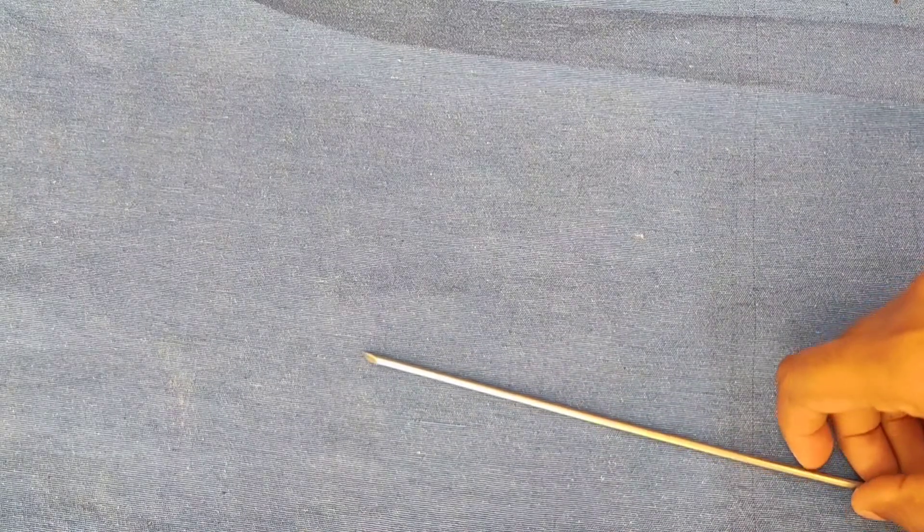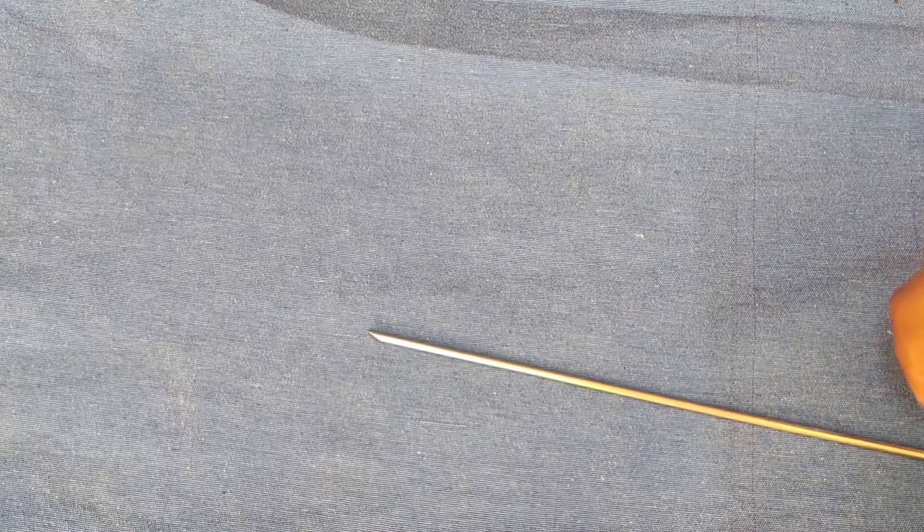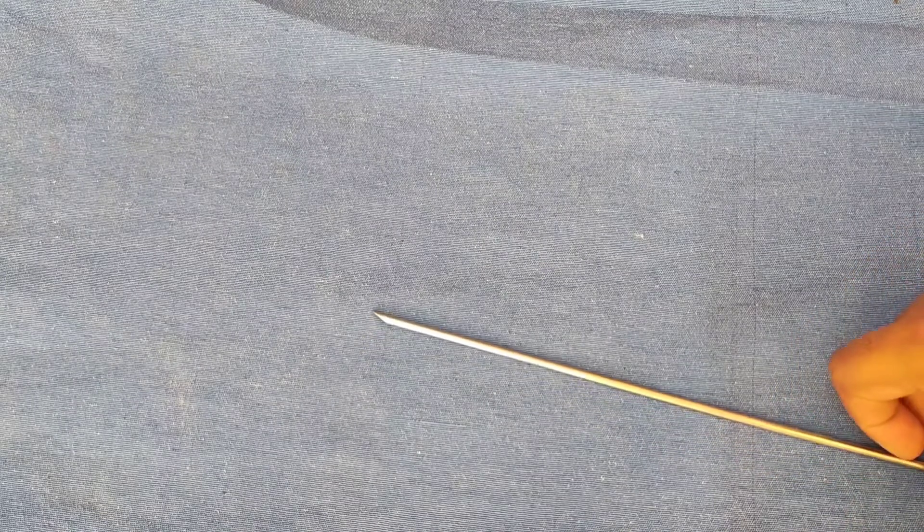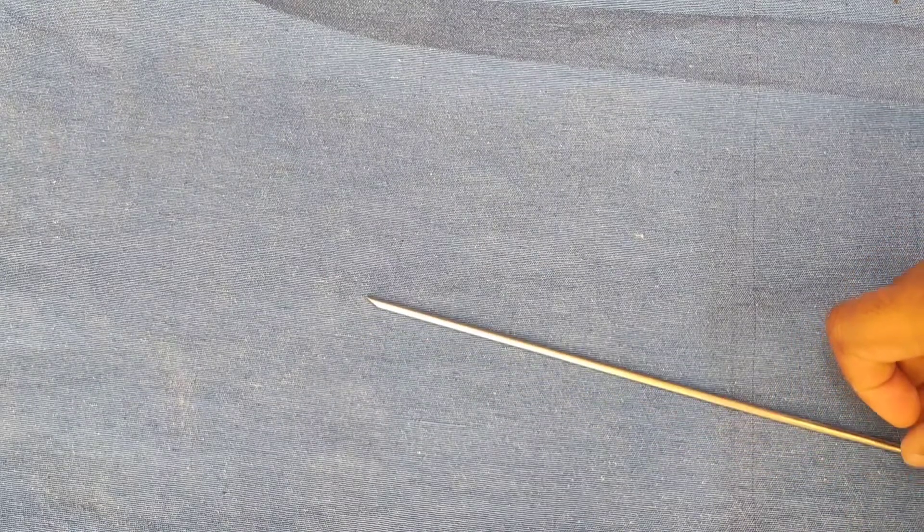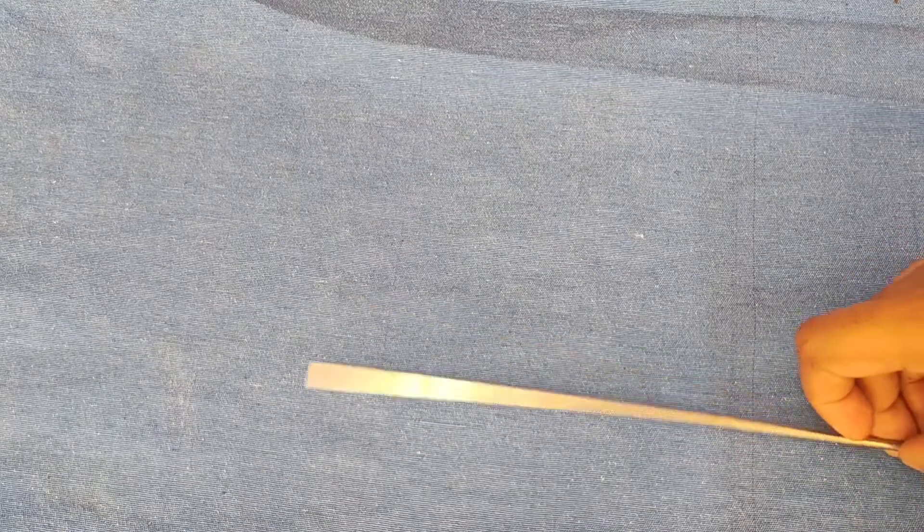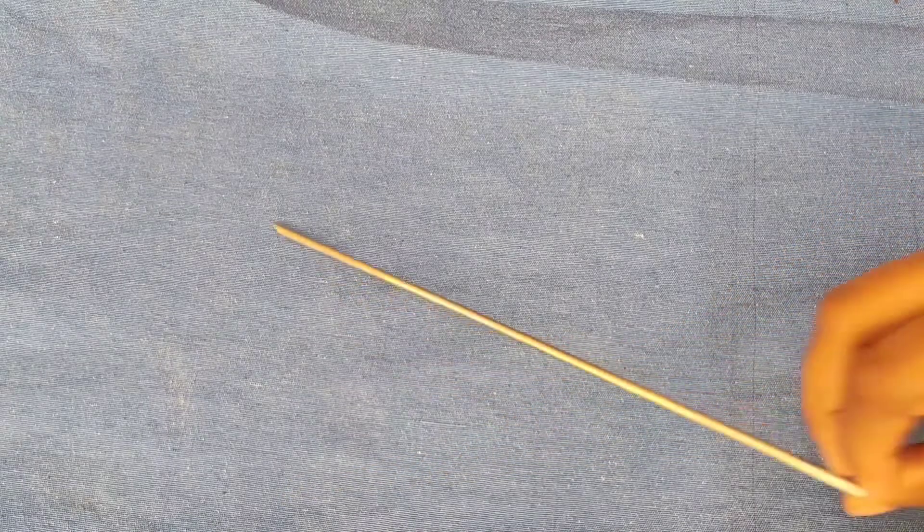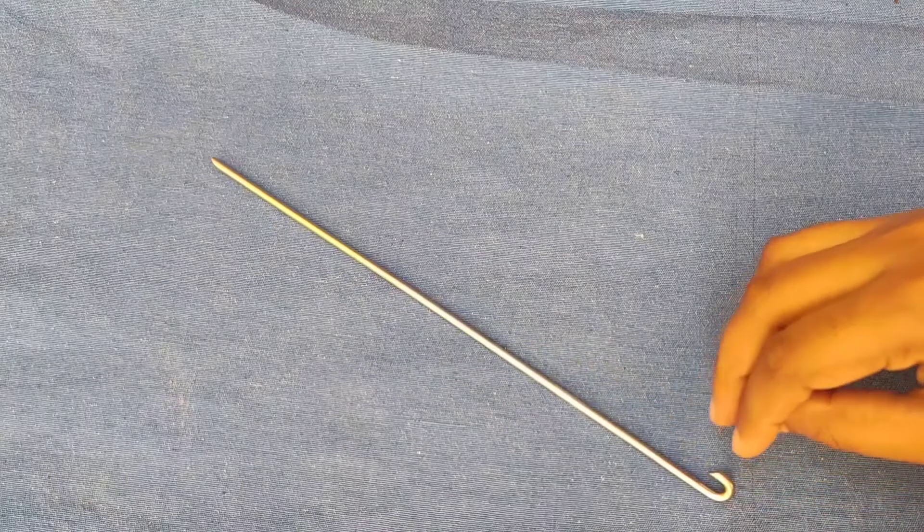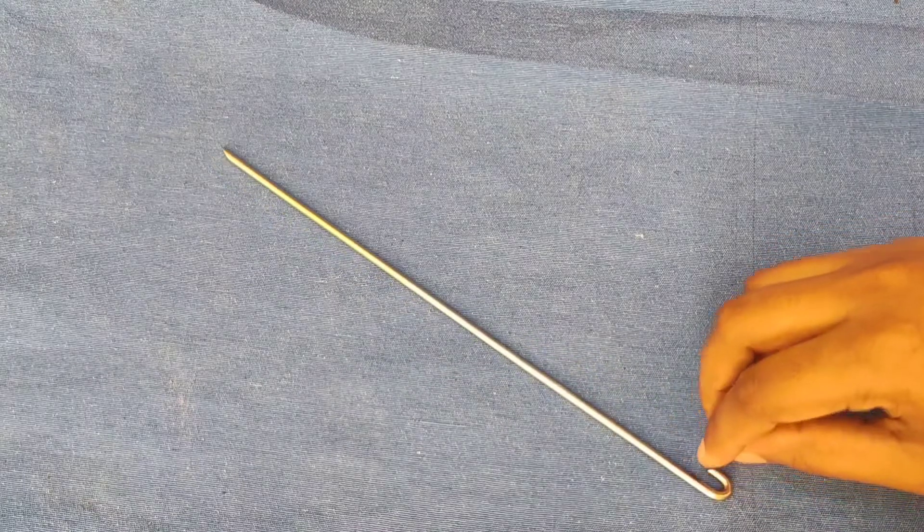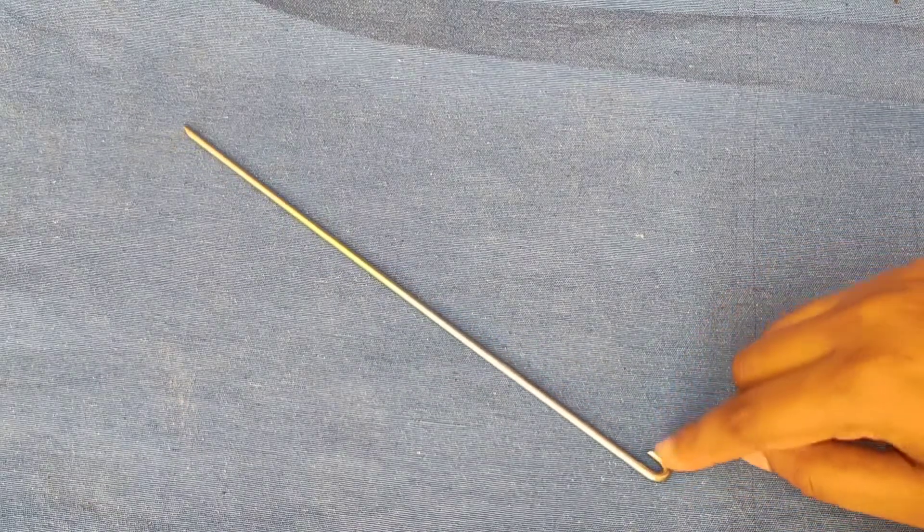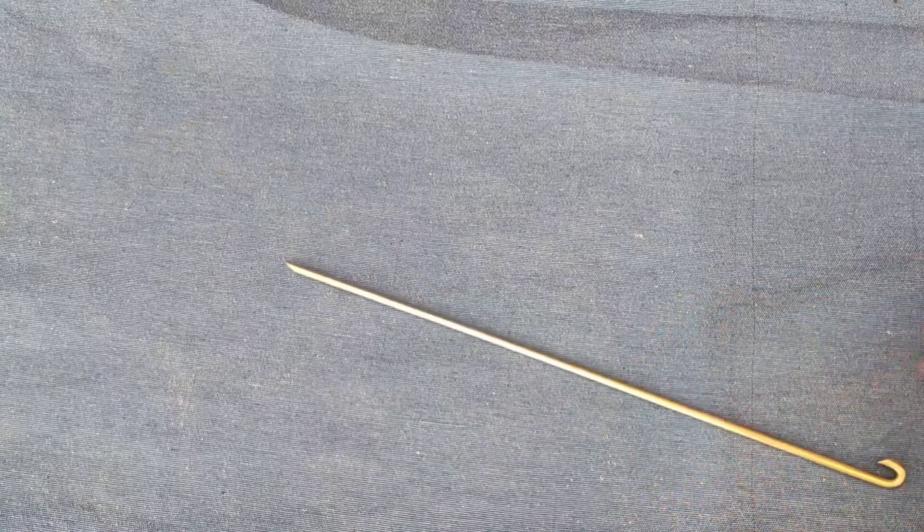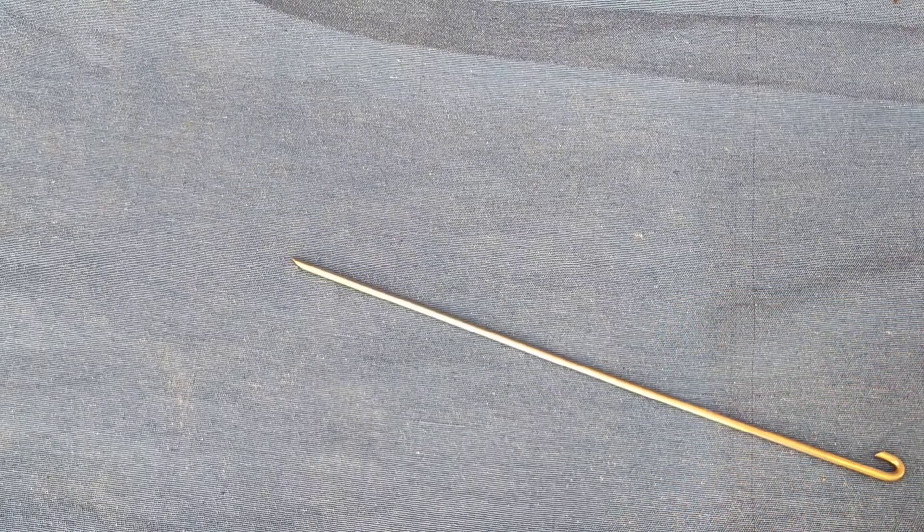Uses: for fracture fibula, fracture both bone forearm. The main disadvantages of the nail are: there is no rotational stability and there is no locking mechanism. Variable sizes are available from 2 to 4 mm diameter in variation of 0.5 mm of various lengths.